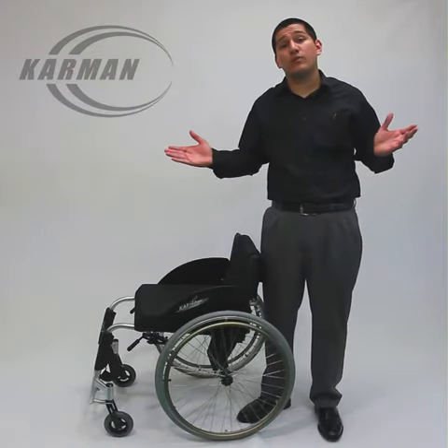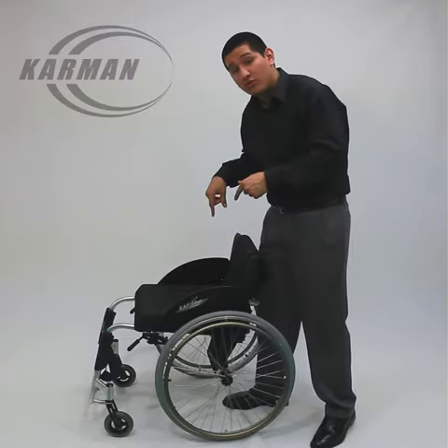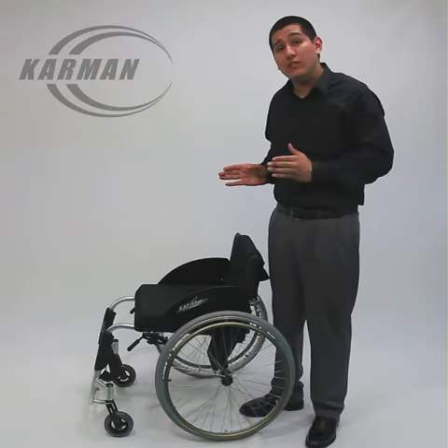We even offer Spinergy rear wheels as an optional upgrade. This does have tension straps on the seat and the backrest. This has your fixed footrest and the chair weighs only 22 pounds.